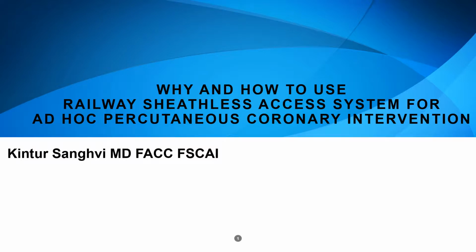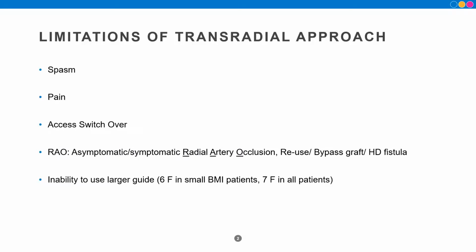Why and how to use Railway Sheathless Access system for ad hoc percutaneous coronary intervention. I learned the transradial approach in 2000, and have performed over 9,000 transradial procedures.